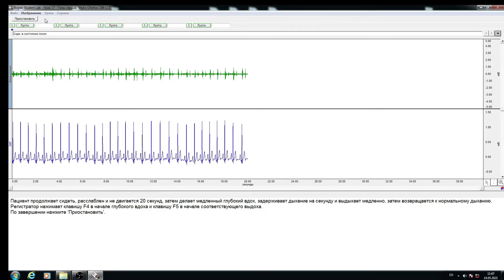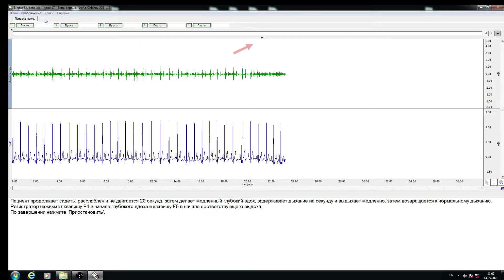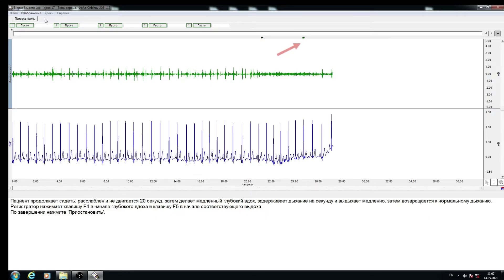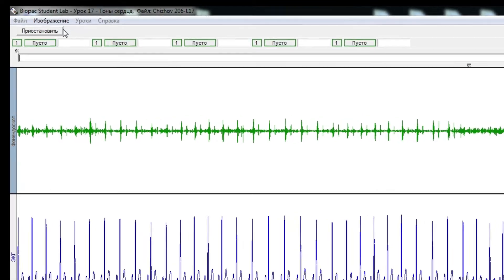After the elapsed time, the recorder asks the patient to take a slow deep breath, hold the breath for one second, and then exhale slowly. At the beginning of inhalation and exhalation, the recorder sets the marker by pressing F9. The recorder clicks Pause after exhalation is completed.